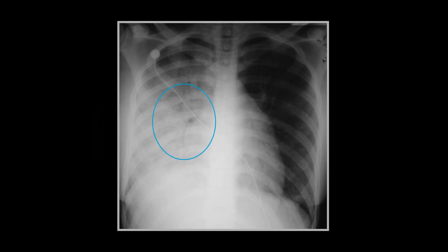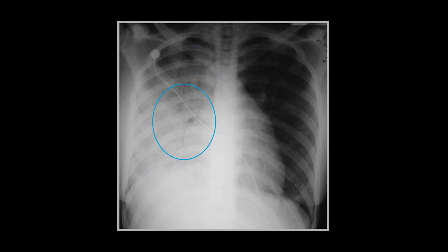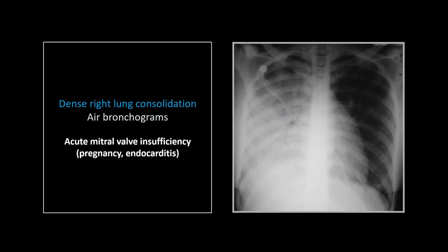This is another consolidation but with air bronchograms, so not post-obstructive atelectasis. You don't see the same volume loss as in the previous case. This is interesting mainly because of the underlying cause — certainly it's pretty nonspecific; it could be an overwhelming pneumonia or a bad lung contusion. What this was, was a pregnant woman who had infectious endocarditis, and this is the classic appearance of mitral valve regurgitation. They burst a papillary muscle, have a flail mitral valve, and go quickly into fulminant right lung pulmonary edema.